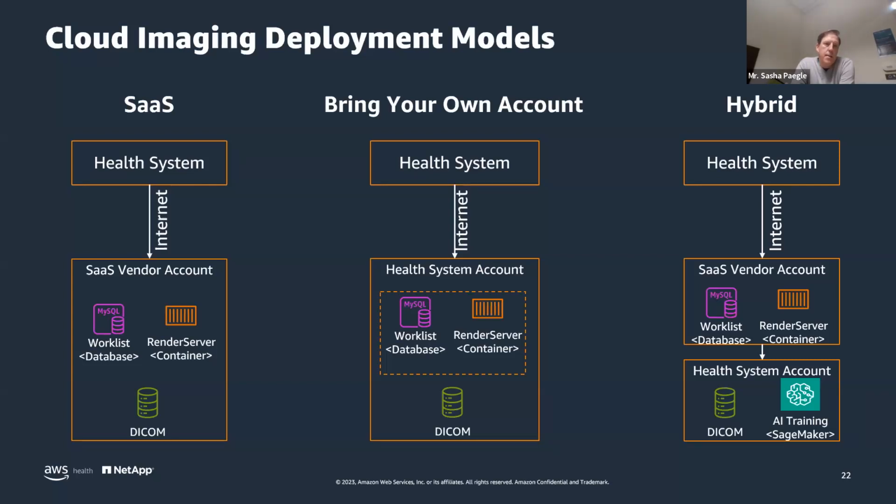On the far left-hand side, you're putting all the responsibility on, or working with, your ISV partner to manage all the images on your behalf. But long-term, what does that actually mean to you, maybe if you're interested in switching to a new solution? On the opposite end, would you actually host your imaging solution in your own cloud as a healthcare provider? And what does that allow you to do in terms of control of managing your images and also being able to introduce new capabilities?